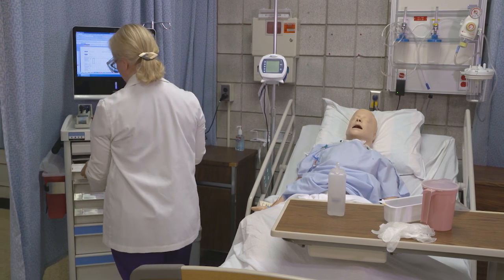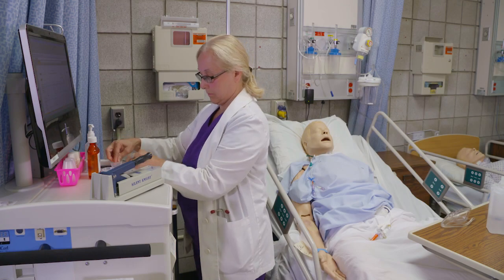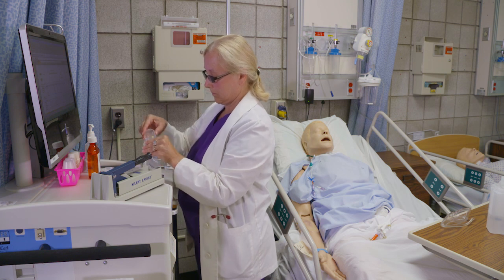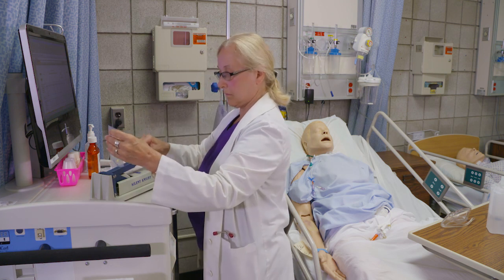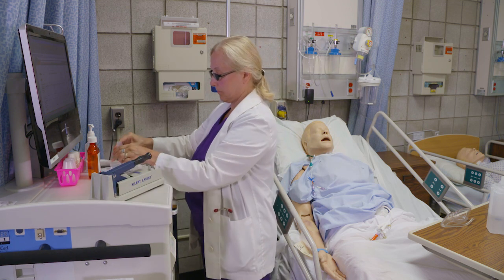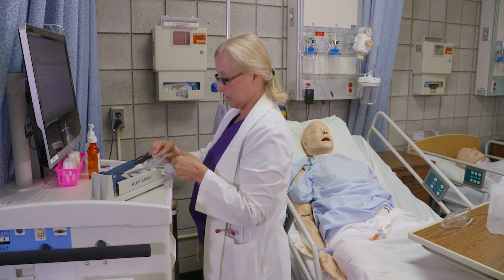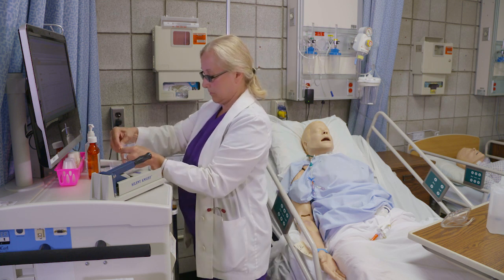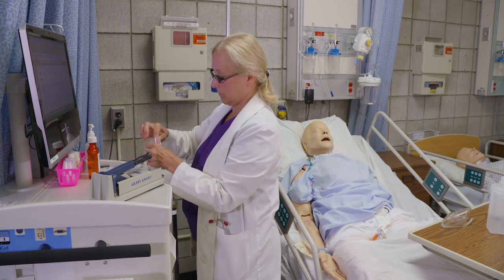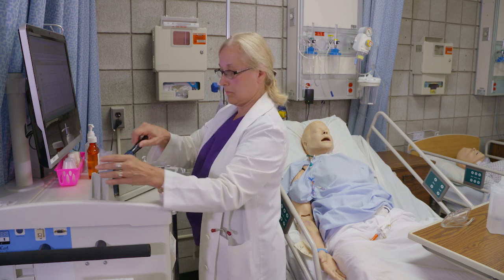All medications must be crushed separately. The nurse crushes each of the meds separately and pours enough water to cover the level of the medication. Remember to review meds that can't be crushed, for example, enteric-coated medication and time-release pills. Never crush a capsule. If it is unbanded, it may be opened and added to water. A banded capsule cannot be crushed. Then pour liquid meds.